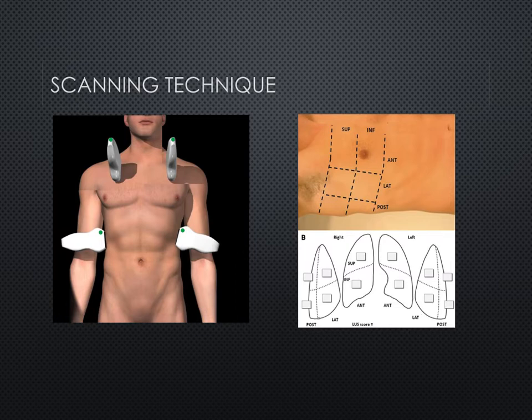So if you look on picture B that I'm showing you just there, it looks like you've only got one reference point, so you're only scanning within one rib space. In actual fact, that's not true. If you're looking to interpret or investigate a region of that lung, it's very acceptable for you to scan at multiple points within the rib spaces within that region.